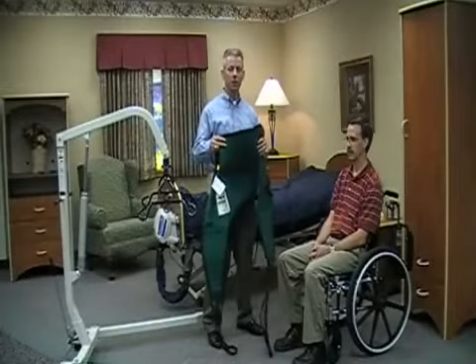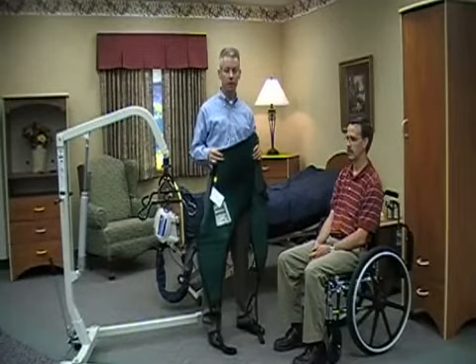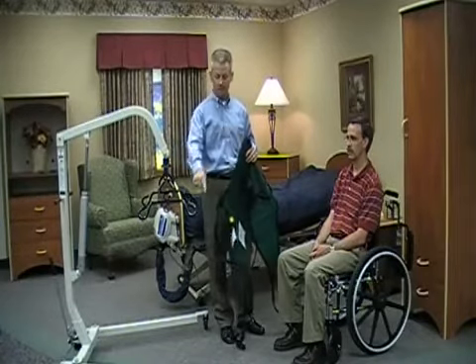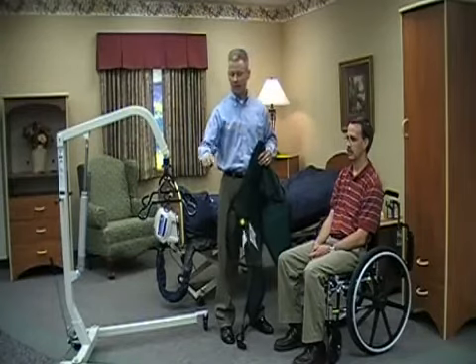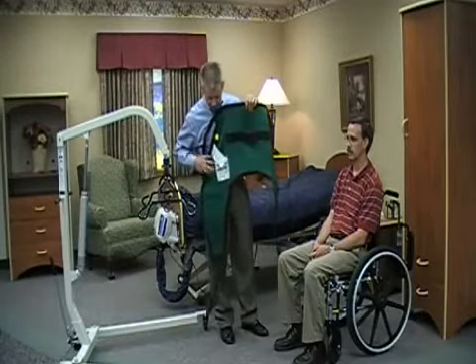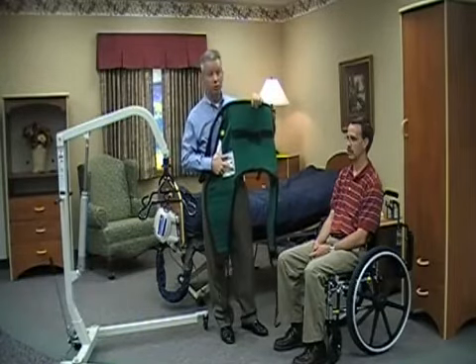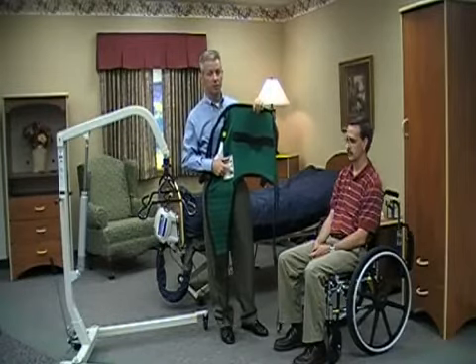Before we begin our transfer, we're going to make sure that we have the appropriate sling and the appropriate lift. We are working with the HML 400, the 400-pound hydraulic lift. I've pre-positioned it so the cradle is about chest height for the resident, and I've also opened the base so that it'll be easier to approach the resident and to ensure that we have a safe transfer. The universal sling has a label on the side that tells me this is a medium sling. We want to ensure that we have the proper size because we don't want to use a sling that's either too large or too small for the resident in question.